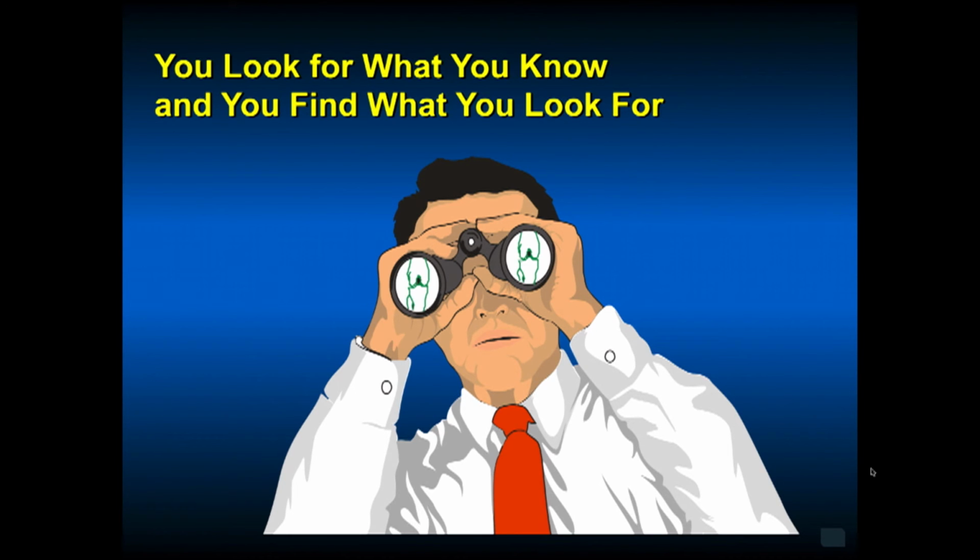So with radiographs and with taking care of patients and interpreting the radiographs, you look for what you know and you find what you look for. So advanced imaging is definitely indicated if something is unusual, out of the ordinary. In my opinion, I would seek consultation from those who you trust, and a good orthopedic consultation is better than a lot of advanced imaging that may not give a diagnosis. Seek earlier consultations rather than getting more radiographic tests.